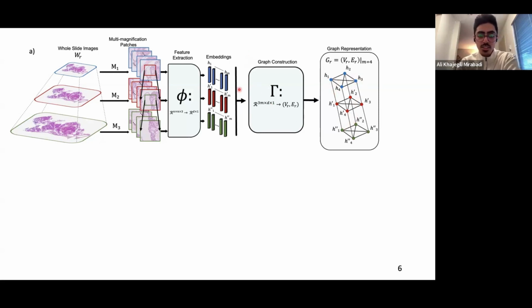So I think we have a question here. Question here, sorry. So in terms of doing this at the whole slide image level, are these patches all... Is it just 4 ROIs you select, or do you patch up the whole image to get these? Yeah, it's random. It basically can be all the patches in the slide. Okay, and so my question is then, in terms of the lower resolution patches, is there a lot of redundancy, in terms of per node, that there's potentially a lot of the same information across many different nodes? Yes, it can be.